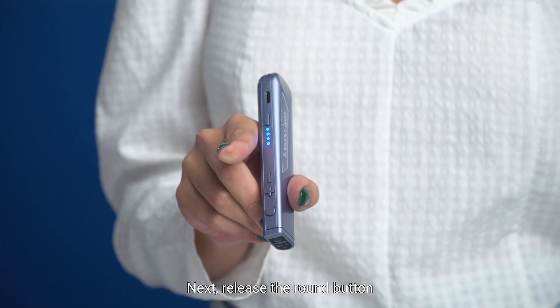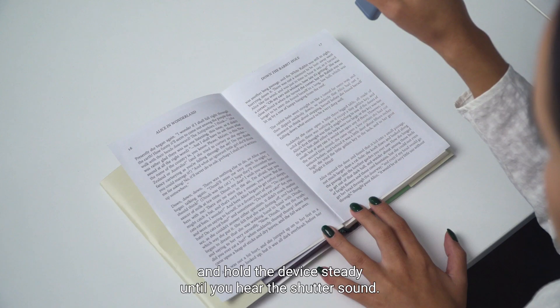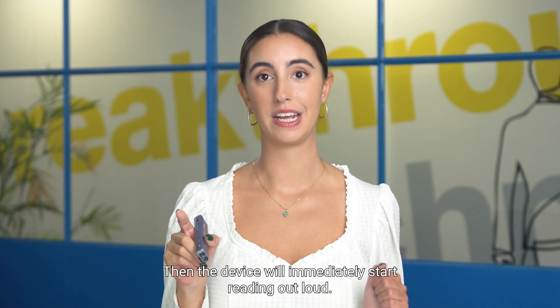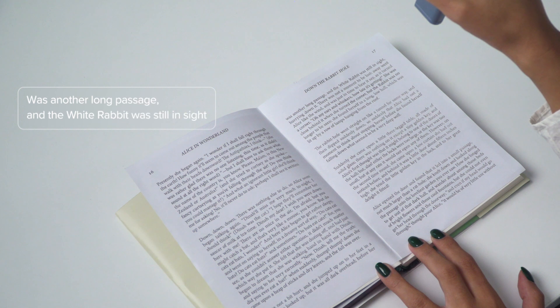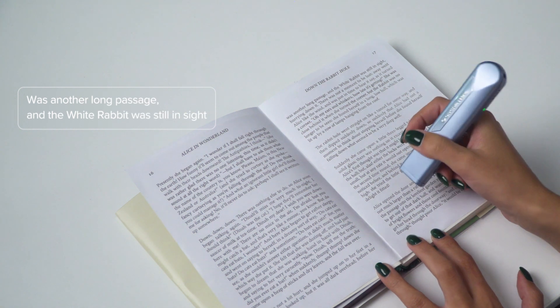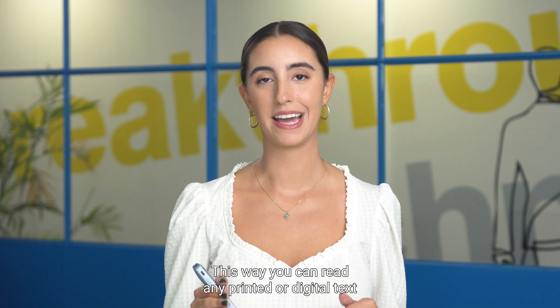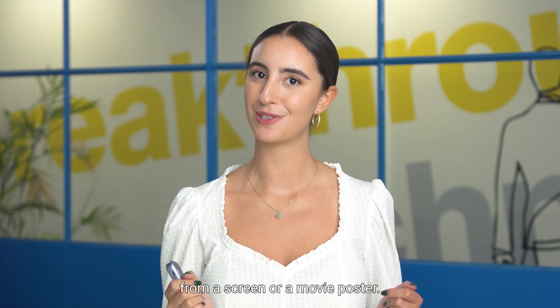Release the round button and hold the device steady until you hear the shutter sound. Then the device will immediately start reading out loud. This way, you can read any printed or digital text from a screen or a movie poster.